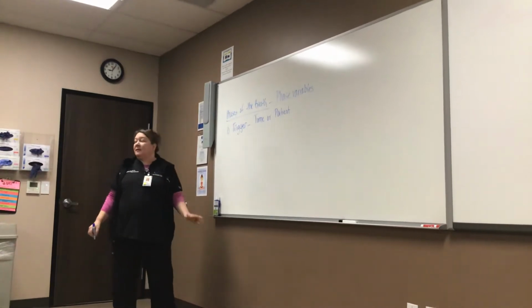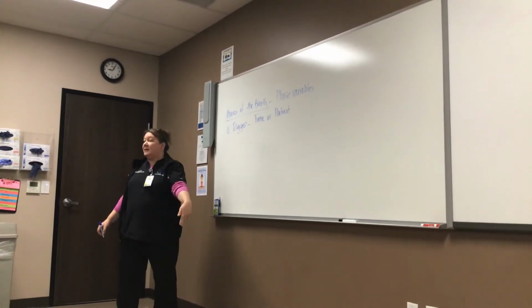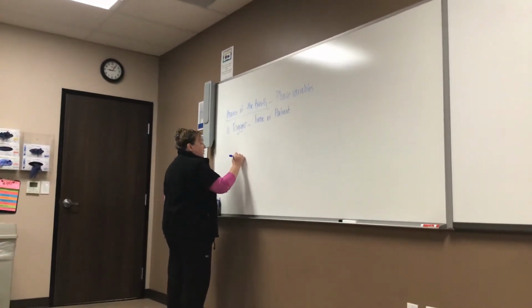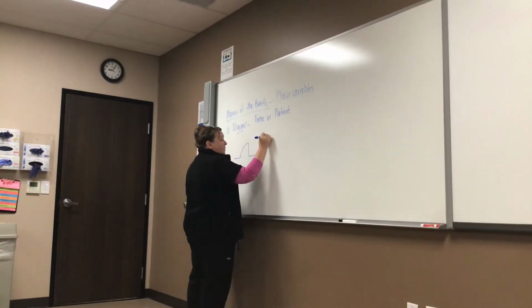So literally, the ventilator will deliver a breath because it's time to give one, or because the patient has triggered it and the ventilator sensed it and said, oh, the patient wants a breath, I'm going to give them one. So that's when it will start. So let's talk about, I'm actually going to need a couple different colors. I'm going to have to go grab some markers.